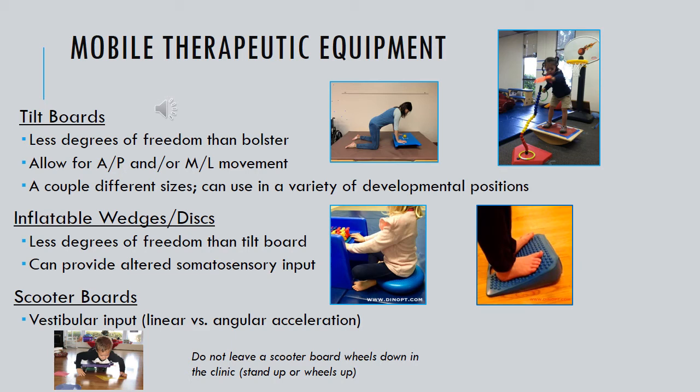Tilt boards also offer mobility to the patient, but they do have fewer degrees of freedom as compared to the bolsters and the peanuts and the balls. They allow for either anterior to posterior movement or medial to lateral movement. They come in a variety of sizes, and you can think about using tilt boards for a variety of reasons.